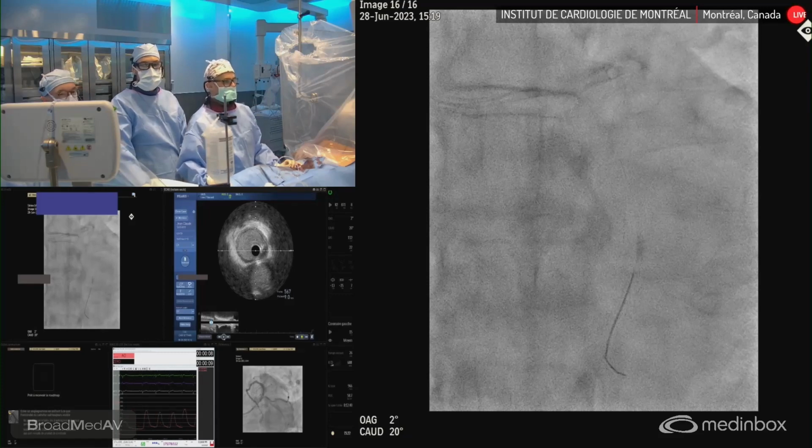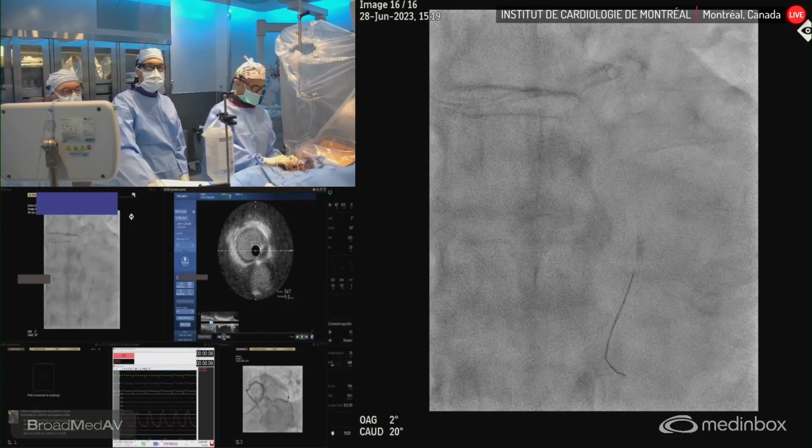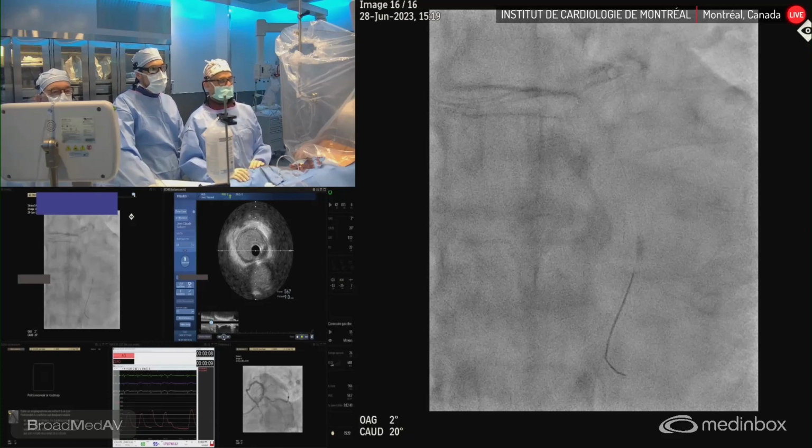So we have the strength of the stent, the size, and then we open. Prepare the shockwave, and then after that, measure the vessel for me from here to the guiding. So when you can open the lumen for the LAD, we can go up to 5 millimeters. So it should allow us to have a great result that we will check after with IVUS to optimize, again, the result, and make sure we have full apposition.